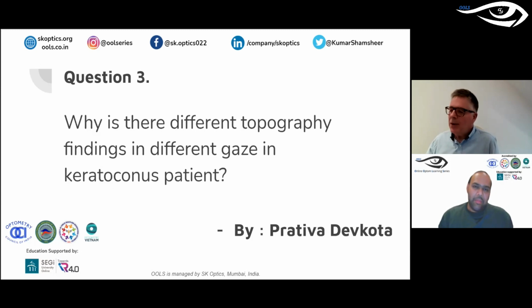We use the Pentacam in the hospital for obvious reasons when we're doing pachymetry, and it has a more advanced contact lens fitting program. But I can't get near it because the ophthalmologists are always using it, you know. So yeah, the answer to that one is: do some research. Make sure it does for you what you want it to do.